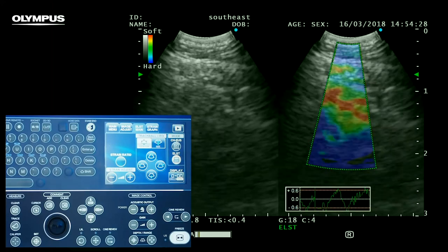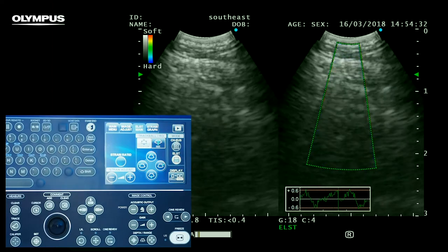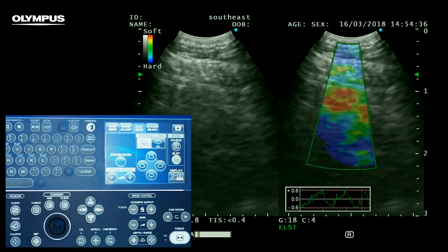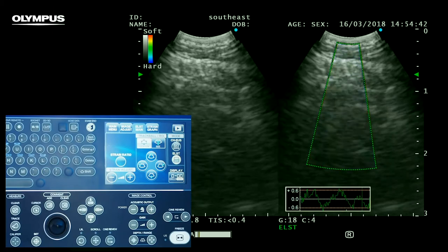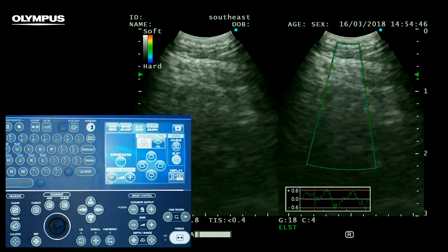We can now go ahead and set our region of interest, or ROI. It's vital to note that we must include our target lesion or node as well as some normal tissue and parenchyma. We should also try to exclude any big vessels to reduce any artefact.